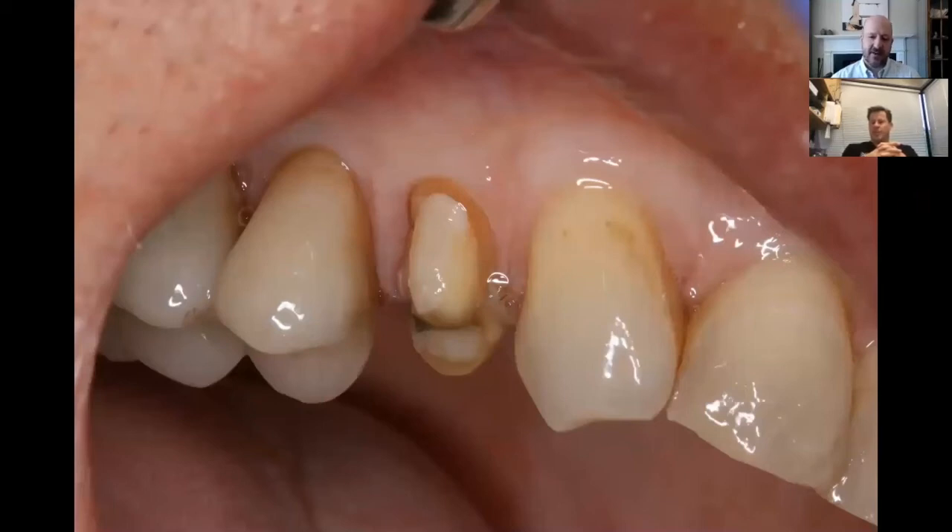I'm a stickler at the end of the first visit about doing everything we can to allow that tissue to heal. If the temporary is well marginated and smooth and the patient knows how to take care of it at home, you end up with this when they come back — and this makes it so much easier to get everything off, clean it up, have gingiva in good shape, and then use resin dentistry. Really a nice setup here.